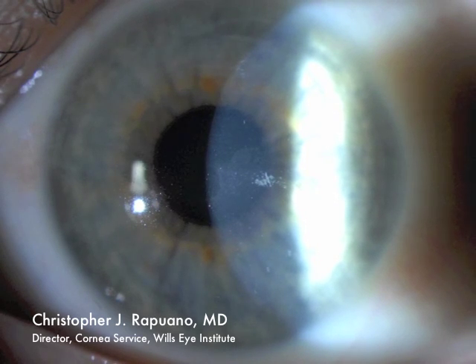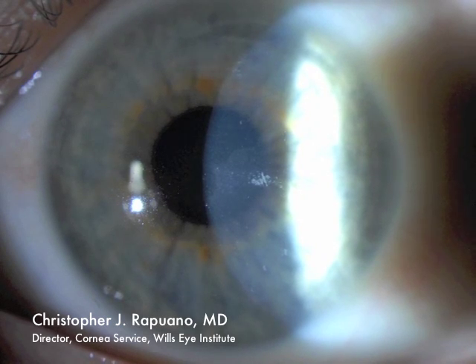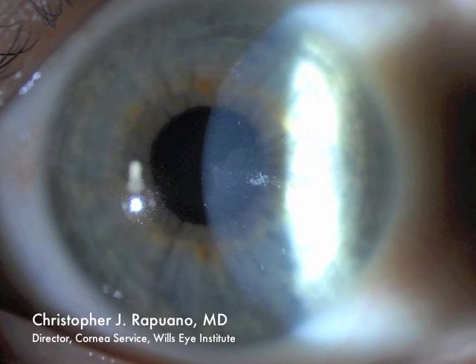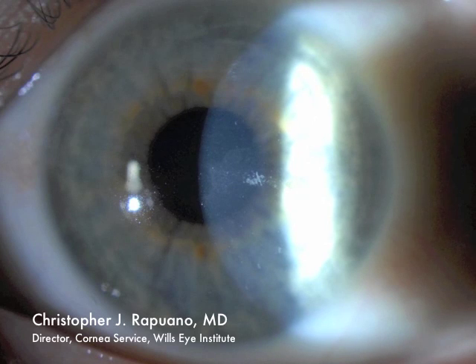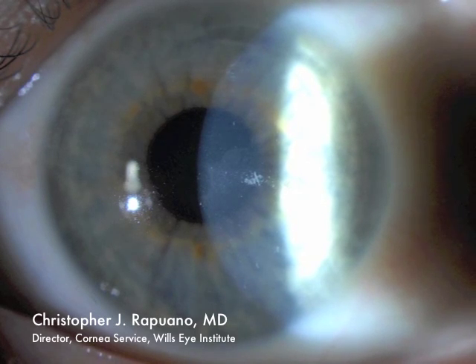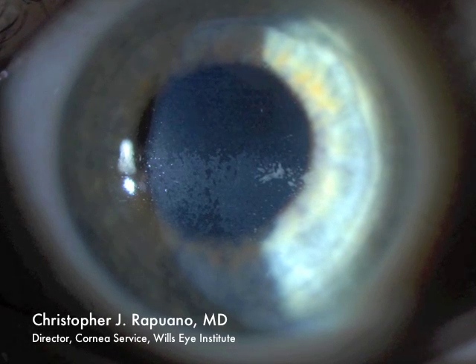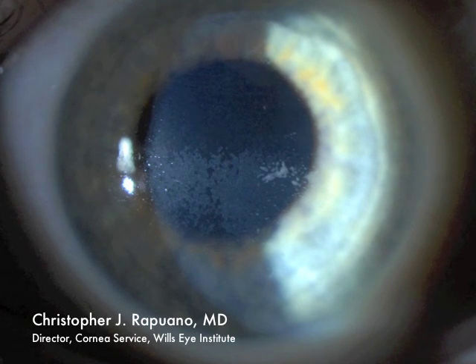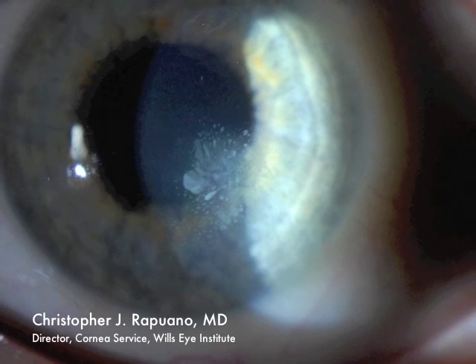This patient underwent successful LASIK surgery for nearsightedness about seven years prior. Unfortunately, she got poked in the eye, which dislocated her LASIK flap. This was surgically replaced, but she had epithelial cells grow underneath the flap. Over the next several months, these epithelial cells grew and grew until they began causing significant decrease in the vision.